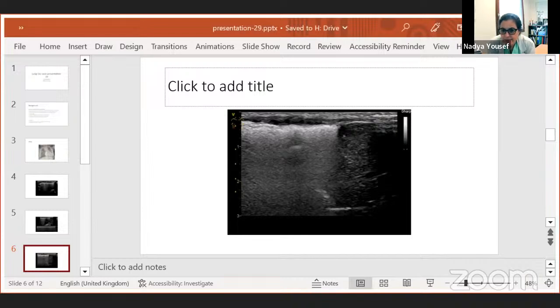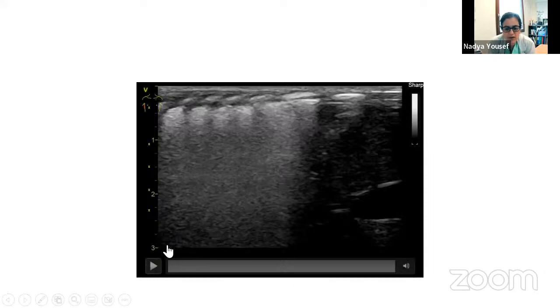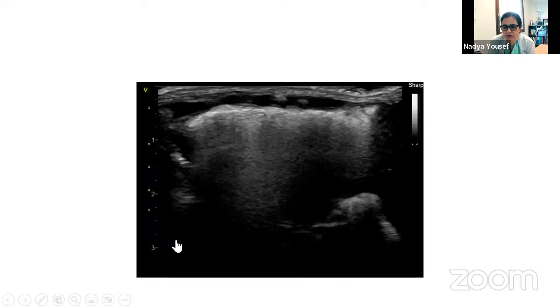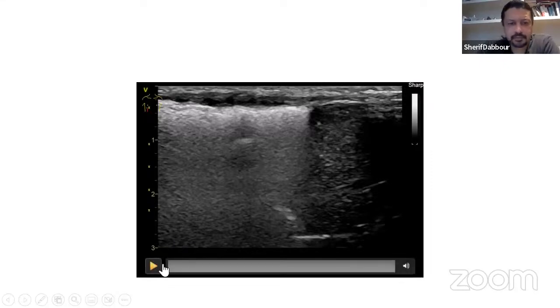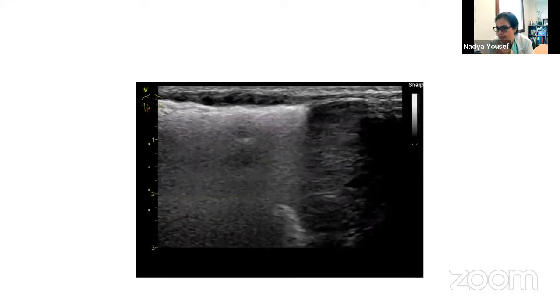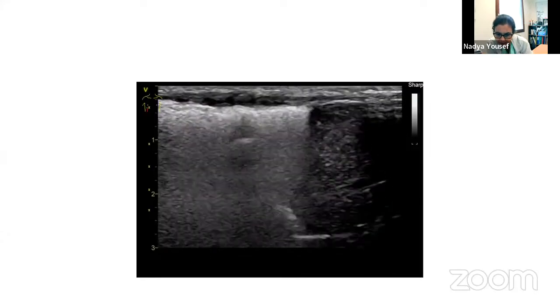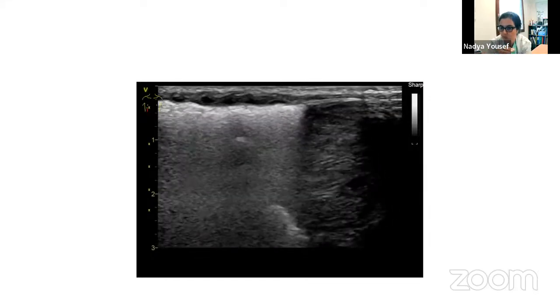That's exactly it. If you had a consolidation that you wanted to see and you wanted to switch the frequency to have better penetration, you would still always have some changes at the level of the pleural line. Because if you don't have any contact with the pleural line, even though it's a massive consolidation that goes all the way down, you will not be able to see it, right? Because it's surrounded by air. So the fact that you do not have any, at least in the clip you're showing us, and maybe if you move the probe, you will see it somewhere else.